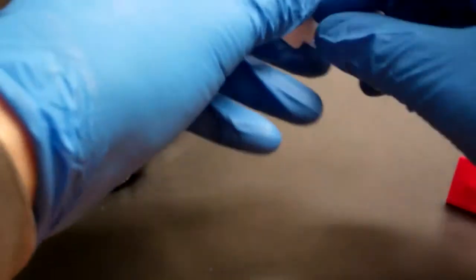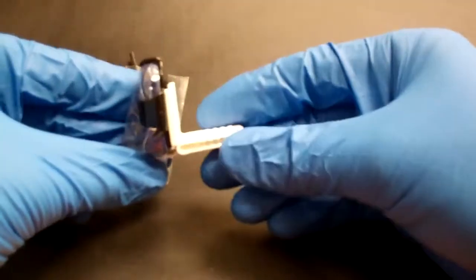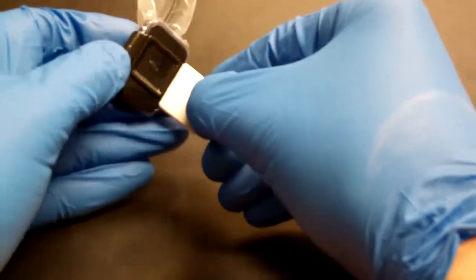And then for our periapical imaging, we use the white bite piece. And it attaches like this for an anterior or from the side for a posterior.